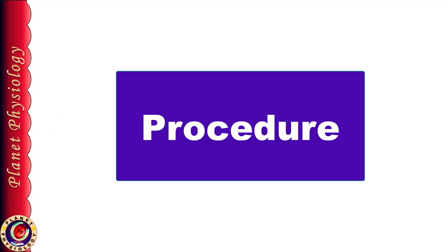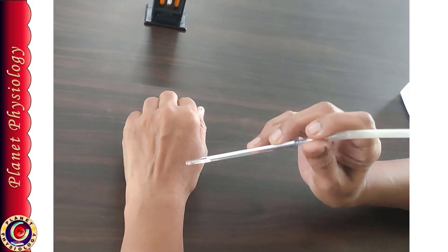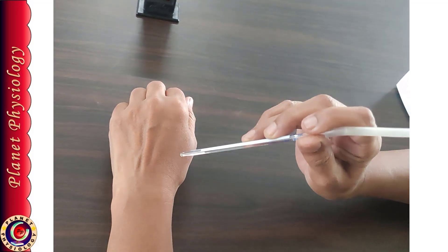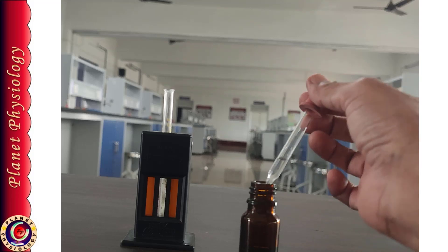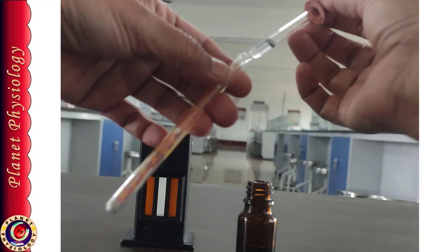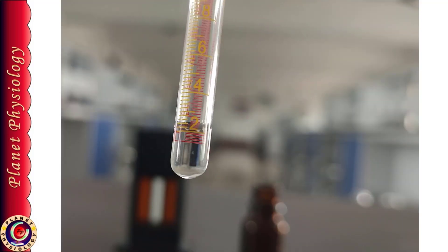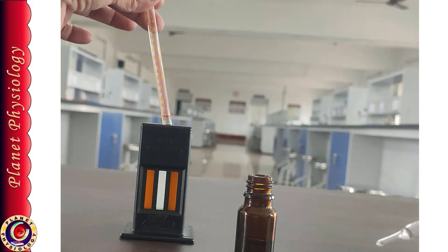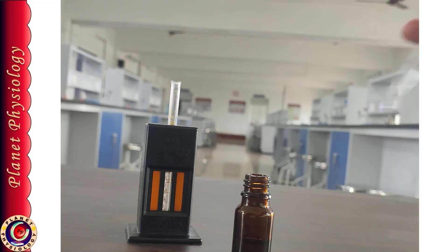Now let's move on to the procedure. First, make sure the apparatus is clean and dry. Also confirm that the pipette is patent — this is easily checked by blowing through the mouthpiece; if you can feel the air current on the back of your hand, the pipette is patent. Take N/10 HCl in the hemoglobin tube up to the lowest mark, i.e. the 2 g% mark, and place the tube in the hemoglobinometer. This is the minimum quantity of acid required to form acid hematin from 20 µL of the blood sample.